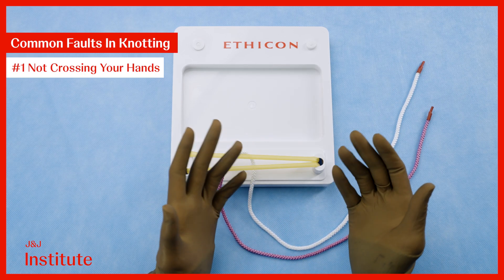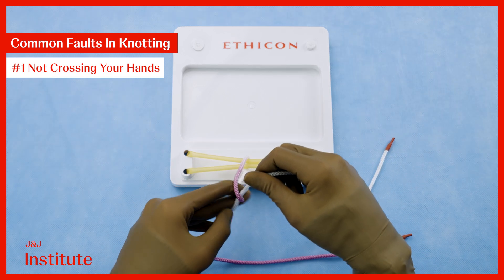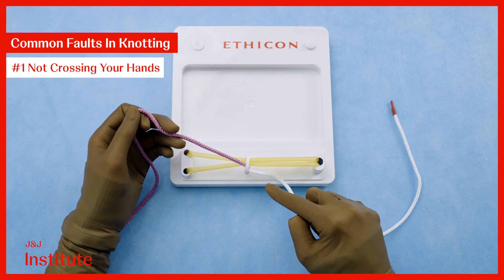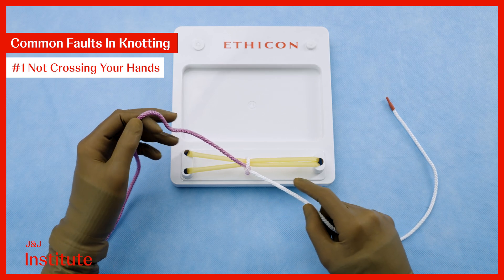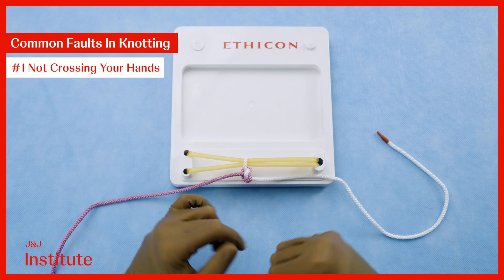What happens when one performs a throw without crossing their hands? You can see the threads do not lie parallel, reducing the friction and therefore the stability of the throw. Additionally, the threads are not in the correct orientation to form a reef knot.